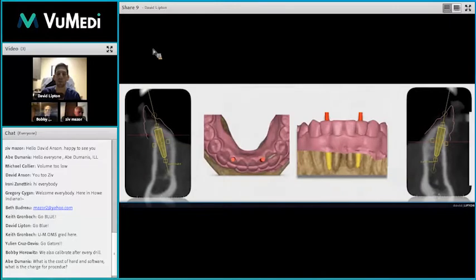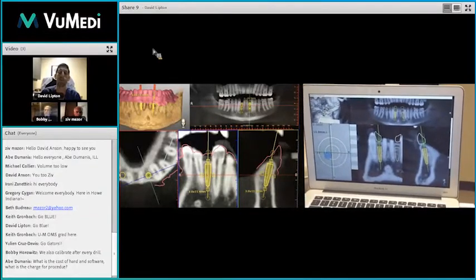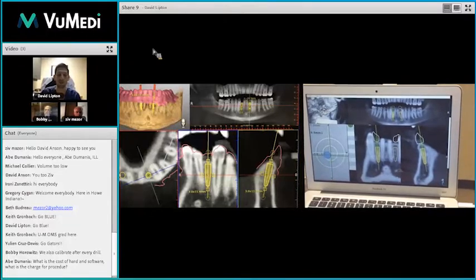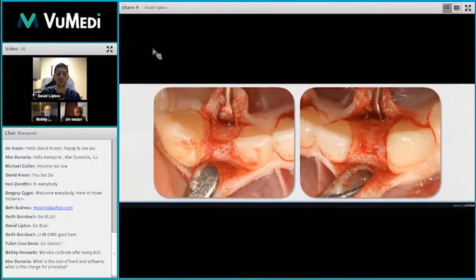And we knew in this case we had to be as accurate and as precise as we possibly can because we didn't want to damage any of the adjacent teeth. So this is our plan, and this is what it's going to look like when we started drilling. And like I said, this was our second case we completed, so we were still learning exactly how to use the software, and we were taking our time, but we knew we had to be accurate and we had to be precise.